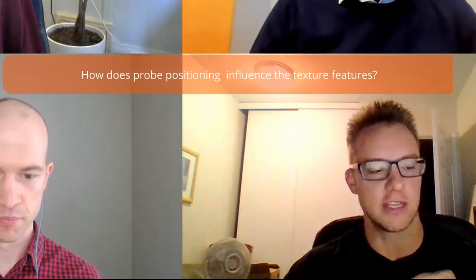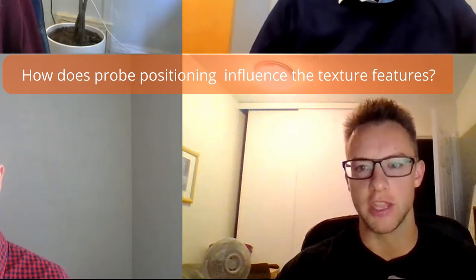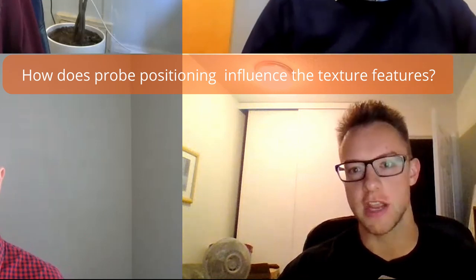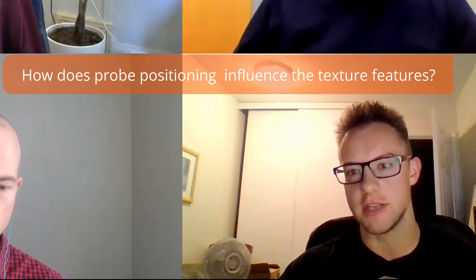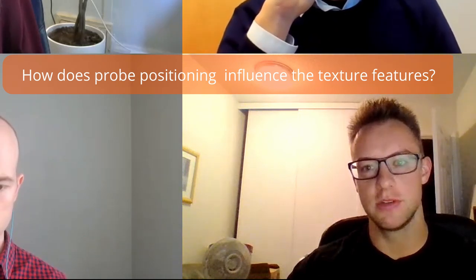I got a long car ride today, but was there much in the way of repeated testing and reliability with the texture analysis? I'm just wondering, with echo intensity, if the probe is slightly tilted or you're a centimeter off, you might get a slightly different reading, but I don't think echo intensity will change much if I'm half a centimeter to the right or left. Whereas I could imagine texture analysis being a bit more sensitive to change if you have one particular tiny section in a muscle where there's just a little bit more fibrotic tissue.